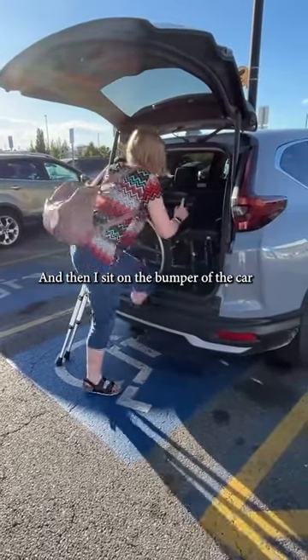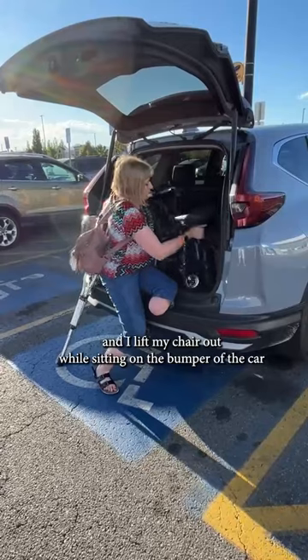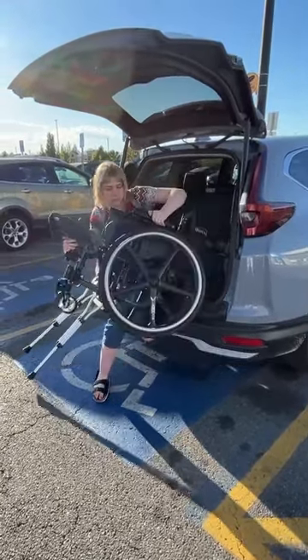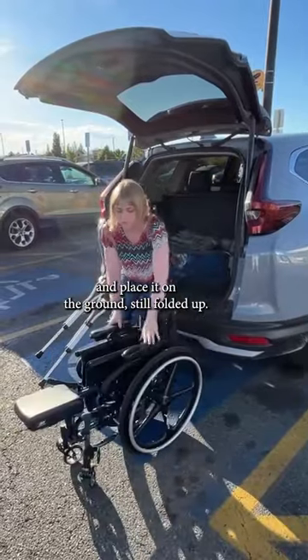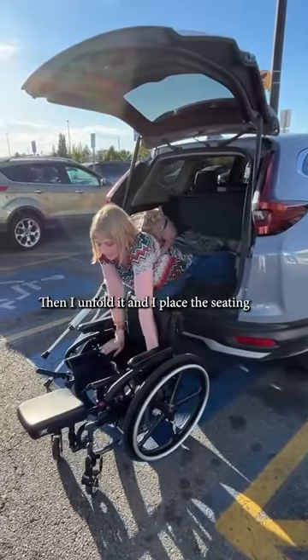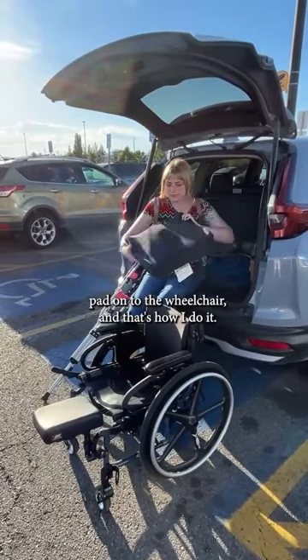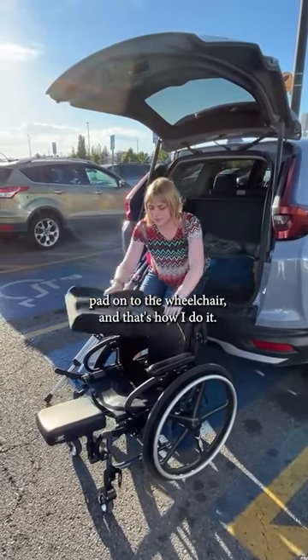Then I sit on the bumper of the car and I lift my chair out while sitting on the bumper of the car and place it on the ground, still folded up. Then I unfold it and I place the seating pad onto the wheelchair, and that's how I do it.